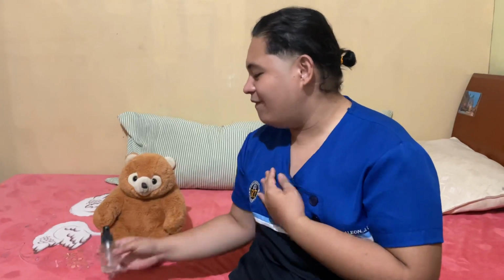We have also identified the patient, and my patient for today is Mr. Vinluan. Hello, Sir Vinluan. I am your respiratory intern for today from San Pedro College. I am J.U. Pantaleon, and I'm going to perform the return demonstration on the metered dose inhaler. I will give you the metered dose inhaler, sir. An explanation of the procedure relieves anxiety about the procedure.